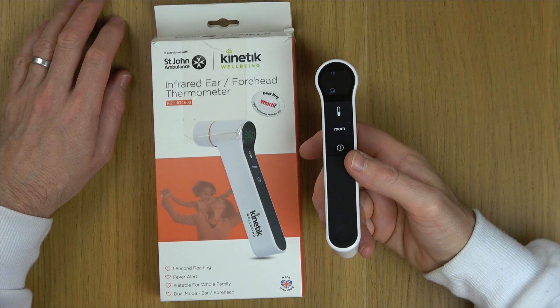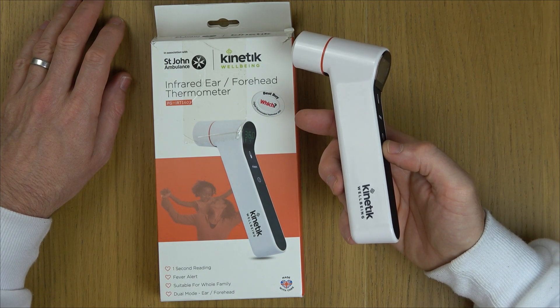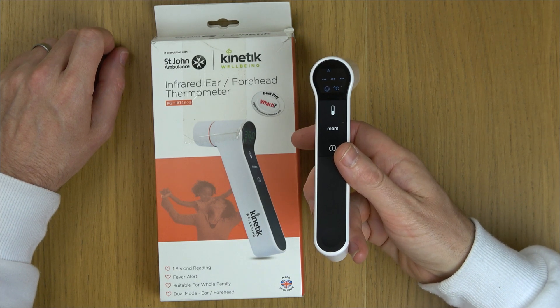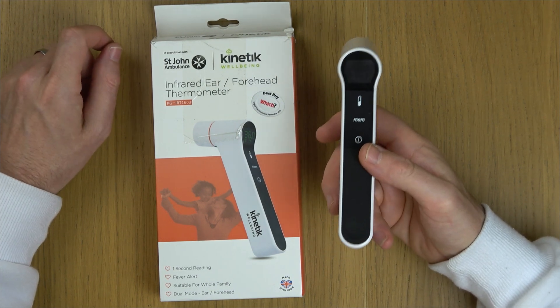In this video I'm going to show you how you can change between Celsius and Fahrenheit on this infrared thermometer. Right now you can see it's flashing in Celsius. If we want to change it to Fahrenheit, we need to first of all turn it off. We can only change it when it's in the off state.